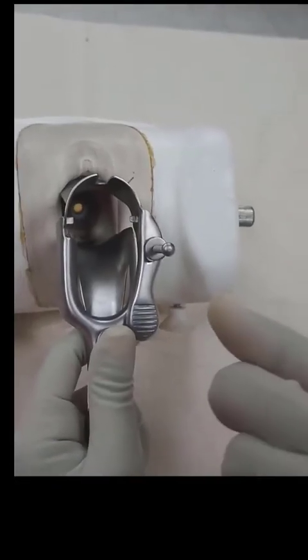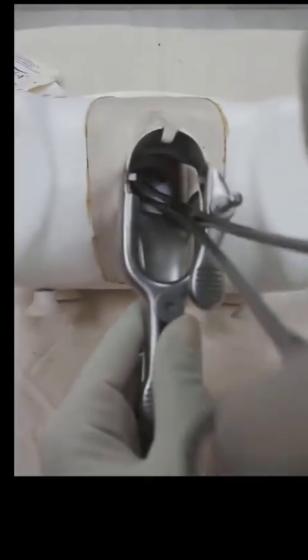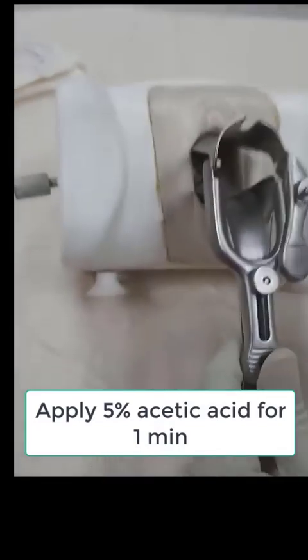Look that the whole cervix is seen. Then a cotton swab soaked with normal saline is introduced into the cervix to remove any discharge or mucus.